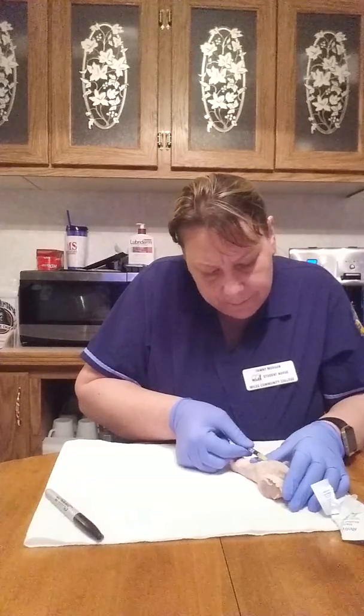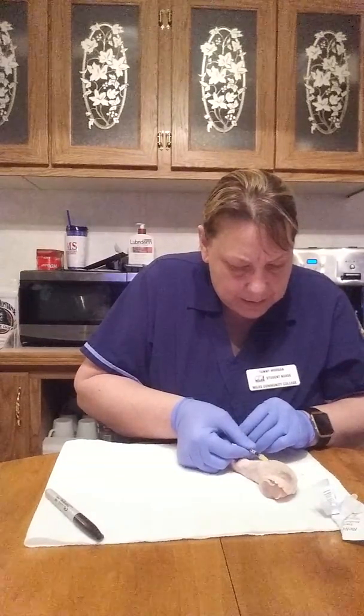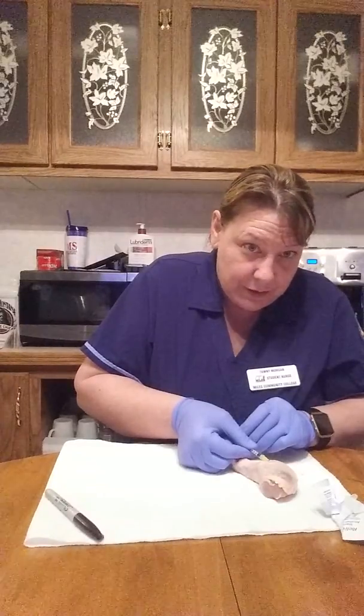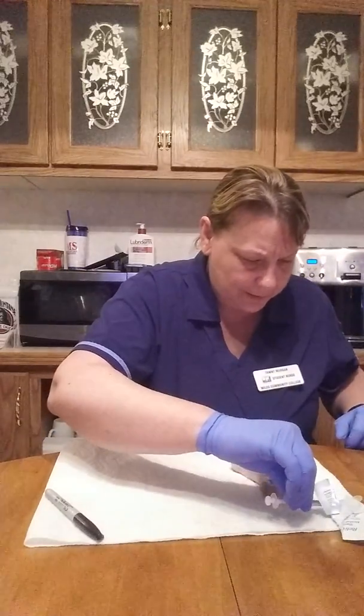Just under the skin. And once I do that, I'm going to go ahead and slowly administer the medication, and I should get a nice little wheal, and I did. I'm going to go ahead and put the cap back on this.